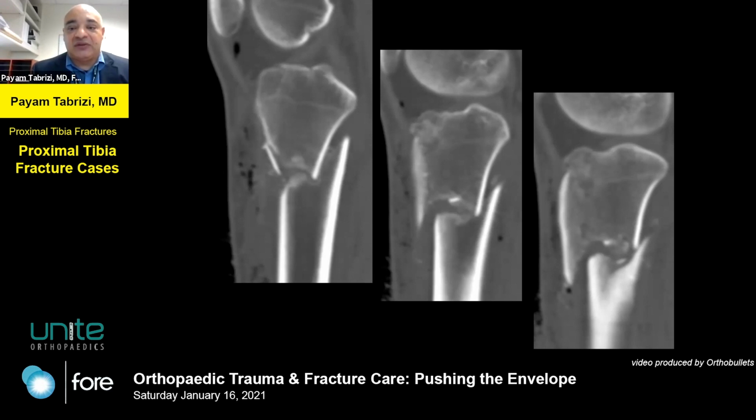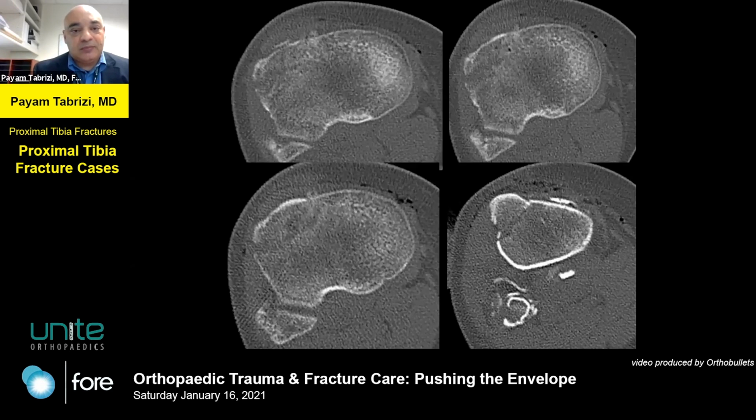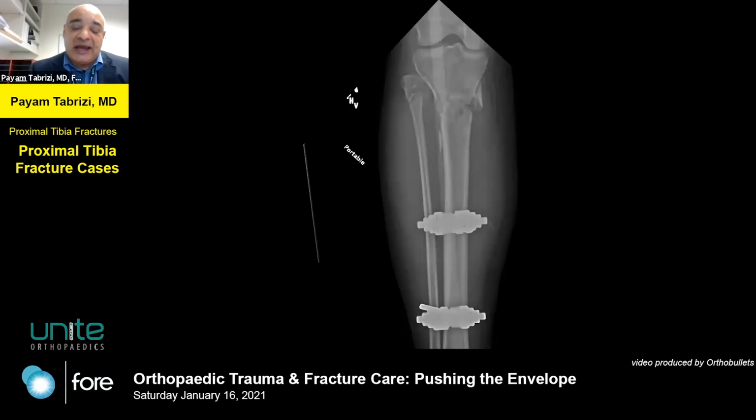It's not that involved. It's kind of like the pilon I showed. It's barely intra-articular, but it is. Other images show the same thing. It's in the joint, but not too bad in terms of the articular congruity. So again, I like X fixes, even if the soft tissues aren't a problem, because I think it lets you get the fracture out to length. It allows you to have some time to plan the surgery. So most of these axially unstable fractures get an X fix, even if their soft tissues are appropriate. And then I plan the surgery.